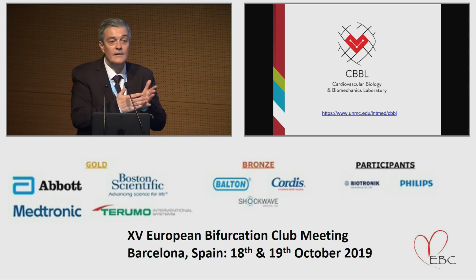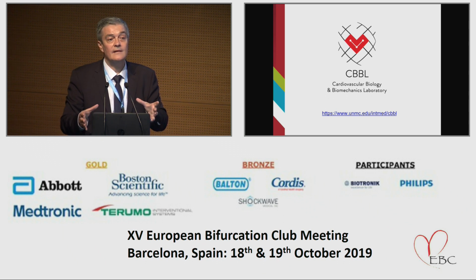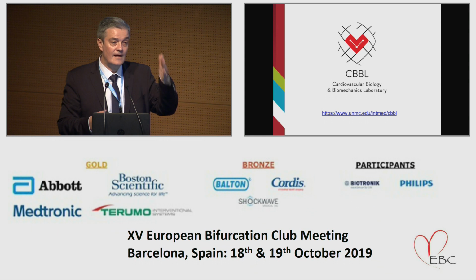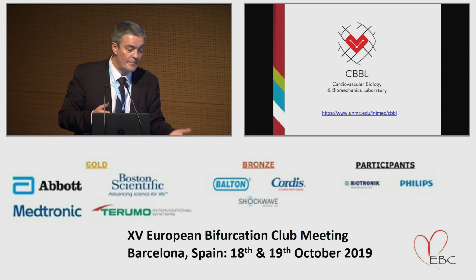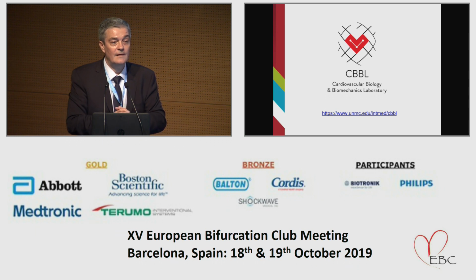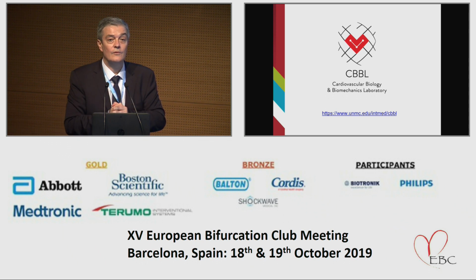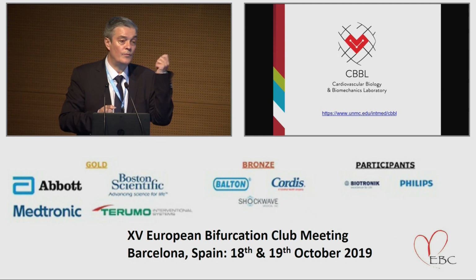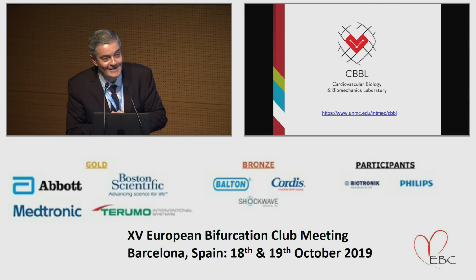In a narrow angle, in order to cover the roof, you really need to protrude. But even in that situation, the advice is to use stent enhancement software and try to be as precise as possible. So TAP is a variation of T, trying to limit protrusion, and Culotte is for when you have adequate anatomical conditions and you want full coverage proximally, then you pull it more and do a mini Culotte. Was that enough?